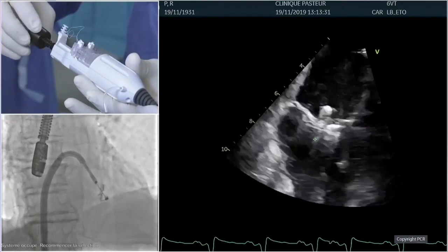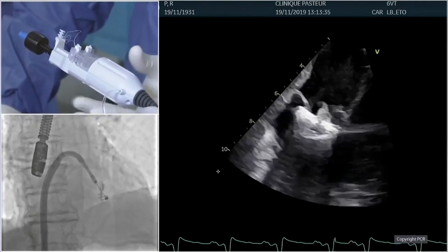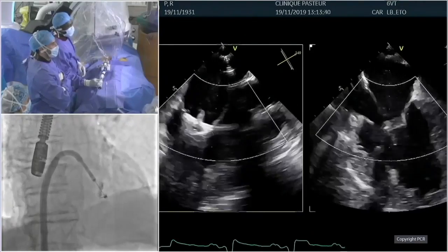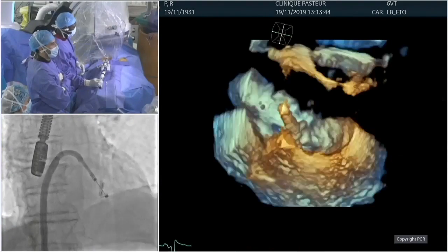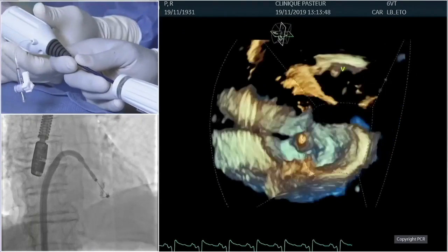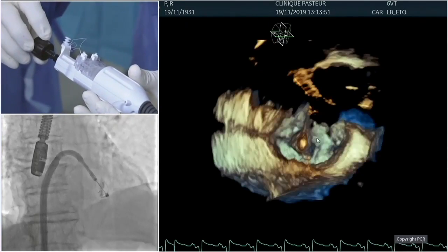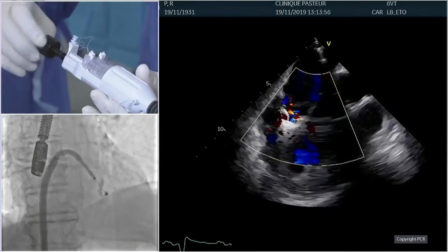What about the clocking at that stage? Just to recheck it again? Yeah, in 3D, you can recheck before closing. Posterior. But it seems that we didn't move that much, given the fluoroscopic image. So I'm quite happy with that. But we follow your order. So we can close. LVOT plus color, Laurent, please. And then we're going to close and see. Can I close, Didier? Yeah, you can close, Nico, I guess.